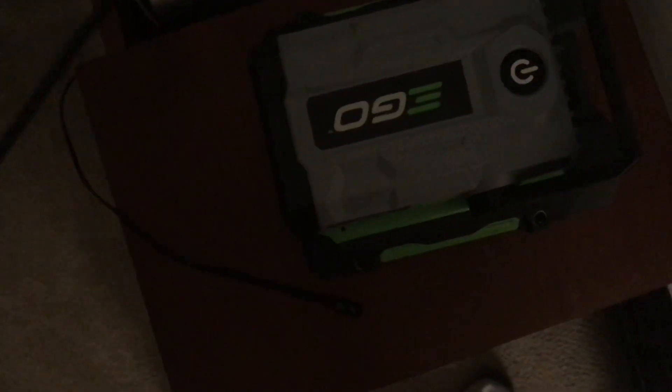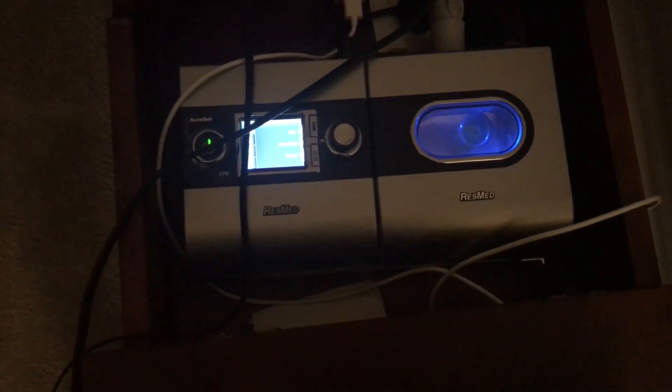My CPAP is just a regular ResMed — pretty standard. Like I said, the power supply says up to 1.5 amps on 120 volt, which equals 180 watts. So let's go ahead and plug it in and see what happens. The CPAP does fire up. This one has a humidifier, so it's going to draw a little extra current — I'd assume it'll be at the high end of that 180 watts, so this may not actually work.